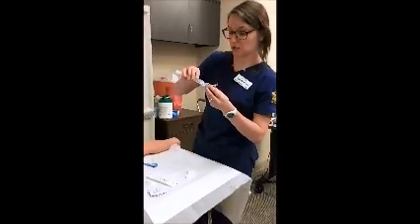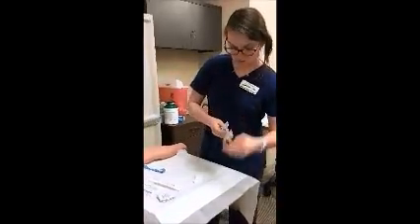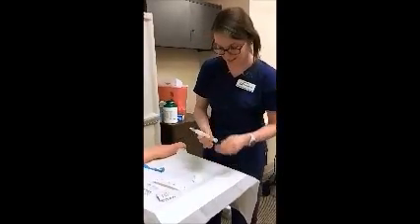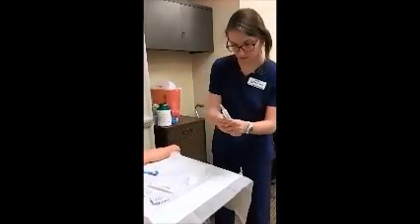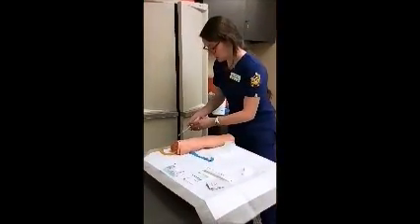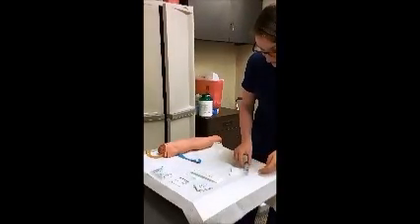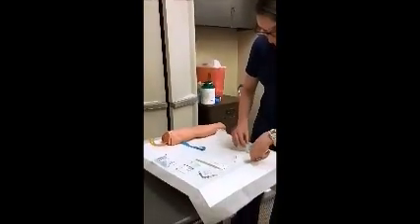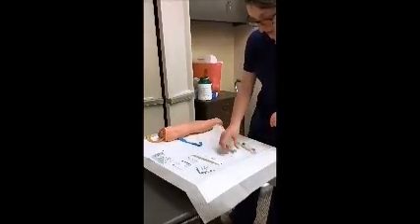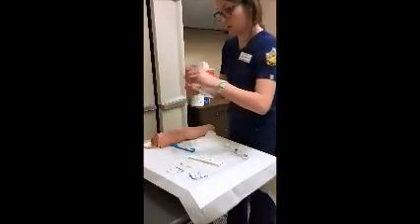So we'll go ahead and attach this. I caught it. Kind of pull back a little, break that seal, and we'll come over to our trash can. That's good and primed, so we can set that right in there. We're still maintaining the sterility of that, not compromising that in any way. Now, we can go ahead and pull this out.